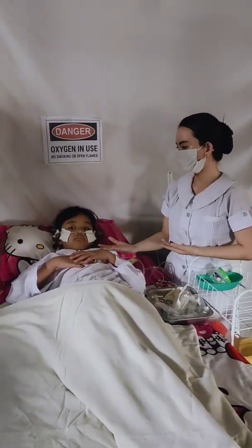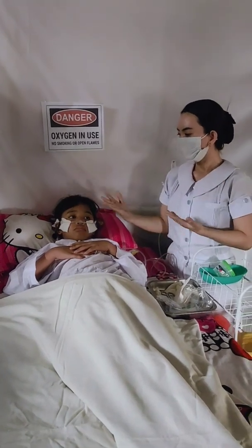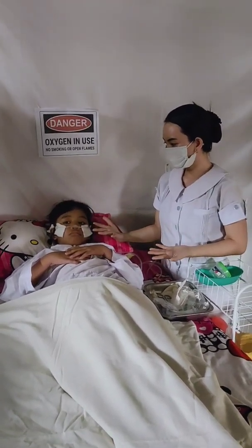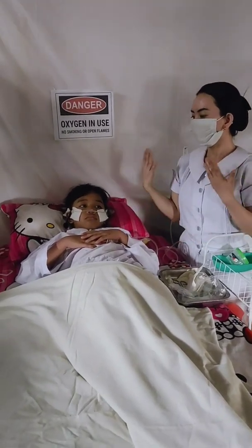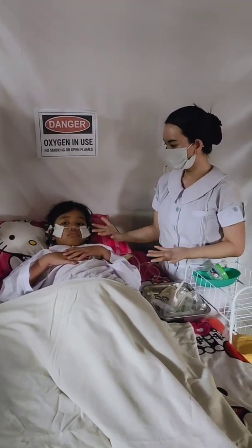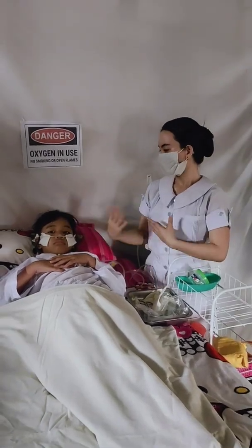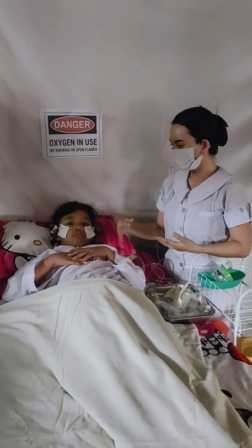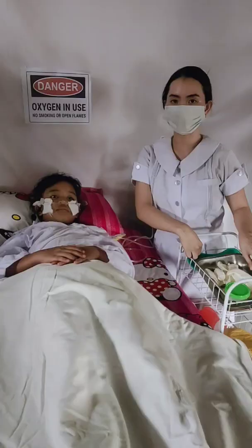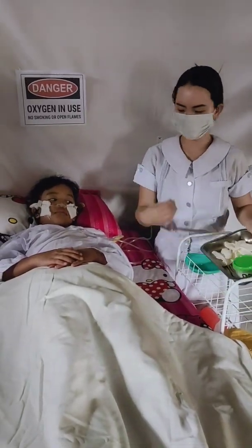Next is to assess the patient's respiratory status, including respiratory rate, effort, and lung sounds. Note any signs of respiratory distress, such as tachypnea, nasal flaring, use of accessory muscles, and dyspnea. This is to help the nurse evaluate the effectiveness of therapy and detect clinical evidence.